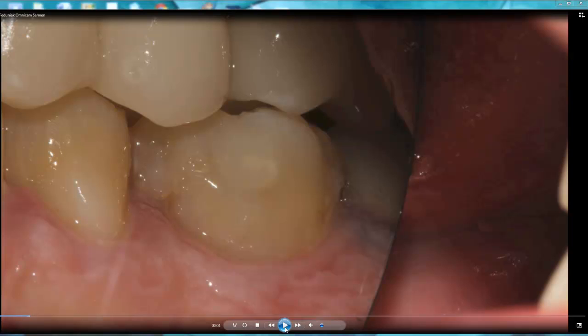So in this case, you see that number 19, number 20 has multiple restorations, has cavities, and some gingival recession. I restored them previously with composite fillings, and today we're trying to restore with crowns. So why crowns, and what type of crowns? We decided to place E.max crowns on the posterior teeth, with a conservative preparation, and due to the high risk of getting more cavities, the crown margin is going to be subgingival. So you will see the approach in this case, and what system I've been using.